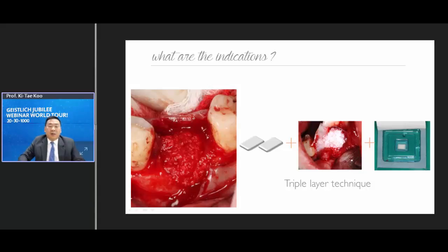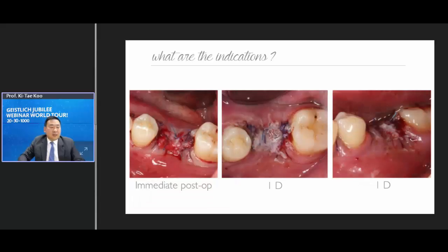However, there is a difference between flapped and non-flapped protocols, and actually the flapless procedures are showing better results. So nowadays, using the open membrane technique mostly. And this is the healing you will see.